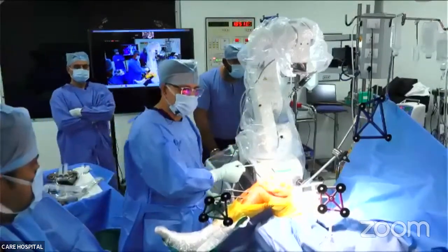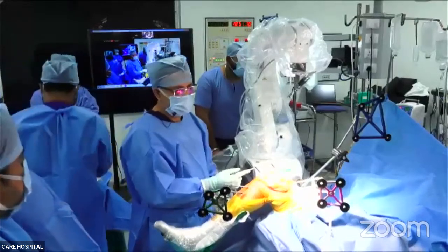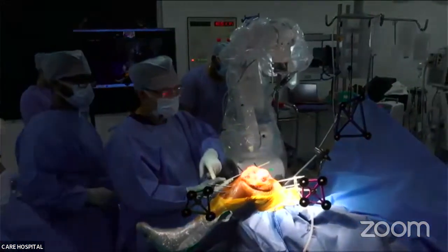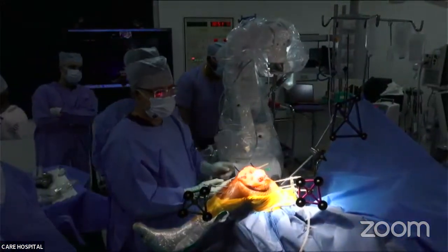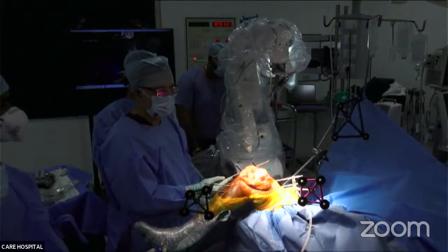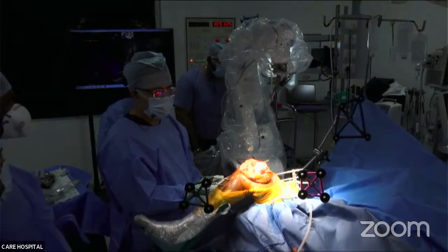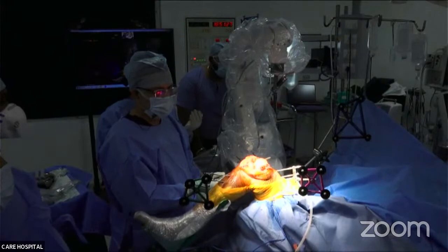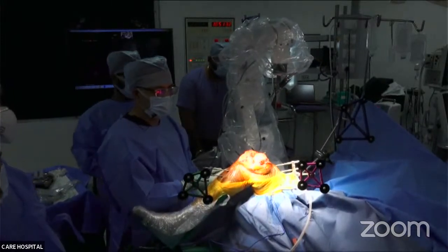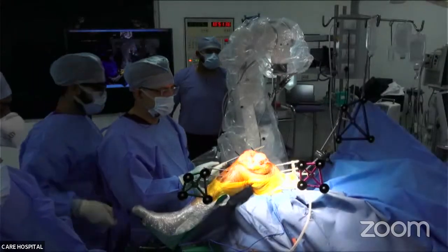So now we are watching on the screen that the optical tracker is seeing both the femoral marker, the tibial marker, as well as the robotic marker. So all three markers are to be seen by the optical tracker. So we are increasing the table height just for better visibility of the optical tracker's markers. Okay. Fix.